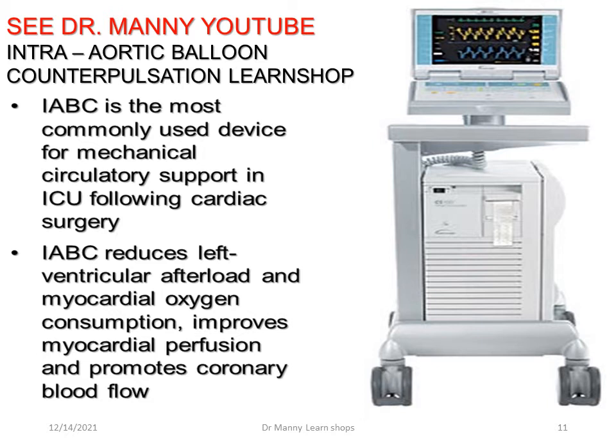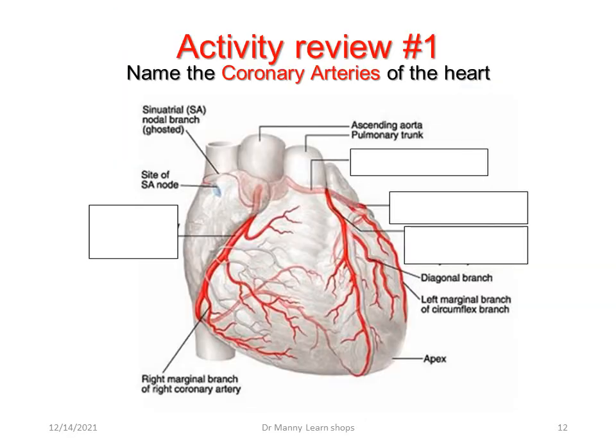Intra-aortic balloon counterpulsation basically reduces left ventricular afterload, makes it easier for the heart to empty, reduces myocardial oxygen consumption, improves myocardial perfusion, and promotes coronary blood flow. So it's important in coronary artery bypass graft surgery, and it may be used prophylactically.